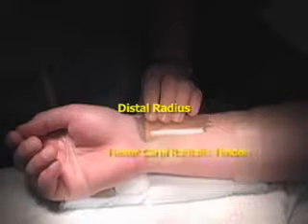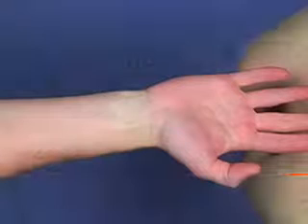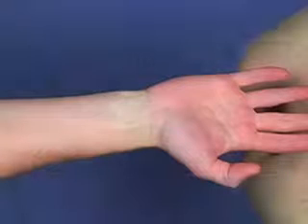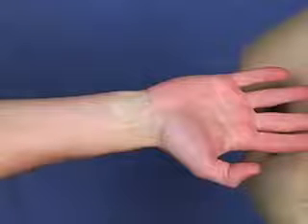The radial pulse is palpated between the distal radius and the flexor carpi radialis tendon. Prior to line placement, perfusion of the extremity should be checked. For radial arterial catheters, an Allen test or a modified Allen test may be performed.